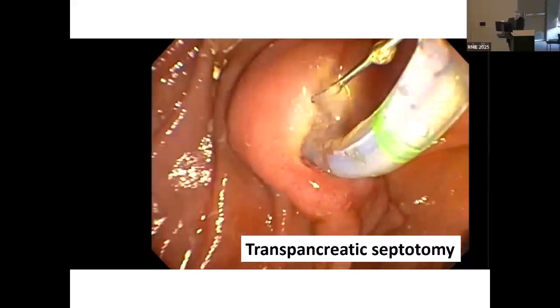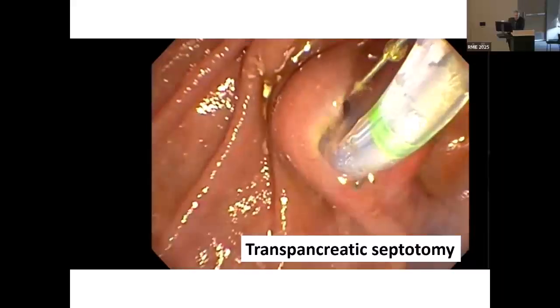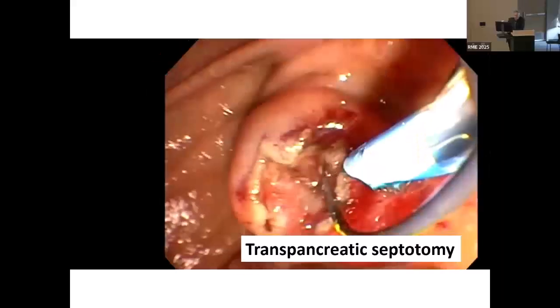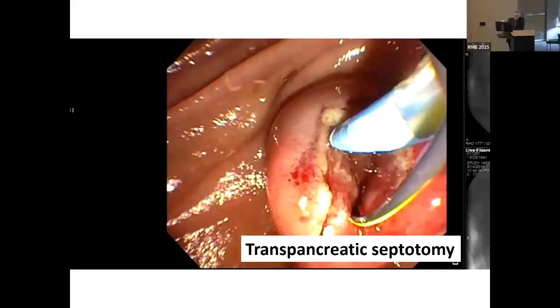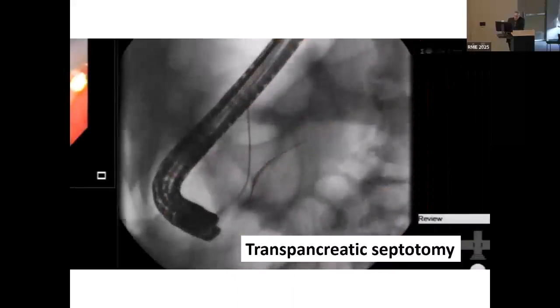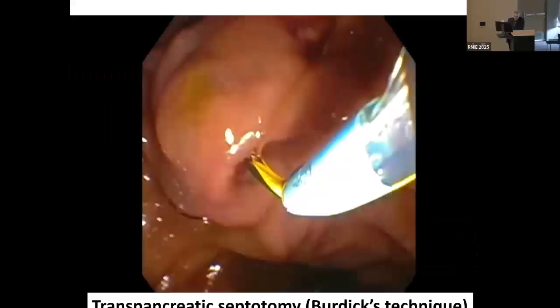You do it slowly, because if you do it fast, you can end up getting to the upper rim, then you get some bleeding, and then you're really stuck at that point. If you do it slowly, you can dissect some tissues and actually find the biliary opening and selectively cannulate it.